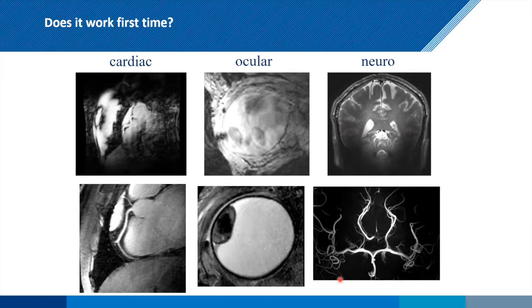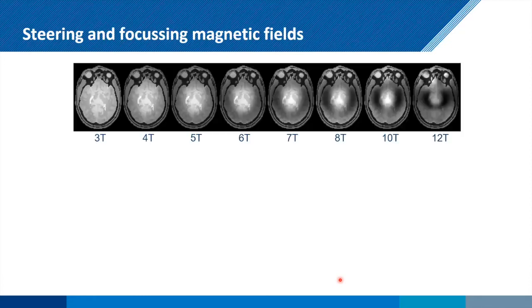So what did we have to develop, and what did we actually learn from the previous work on high field? Well, the first thing is, how are we going to steer and focus magnetic fields? One of the problems, of course, is that the RF interferes with the conductivity and with the permittivity of the body a lot at high field, much more than at low field. But it also gives us an opportunity to steer those by saying, if we take dielectric materials, materials with high permittivity, we can start to reshape the magnetic field and indeed the electric fields, right?